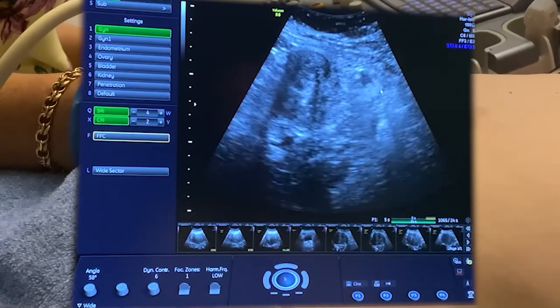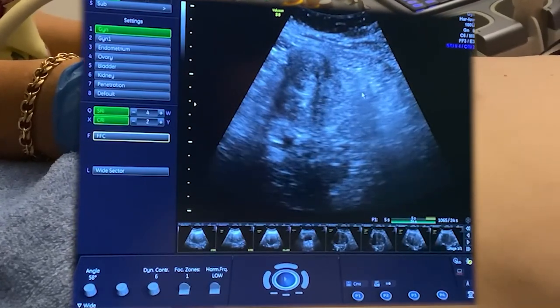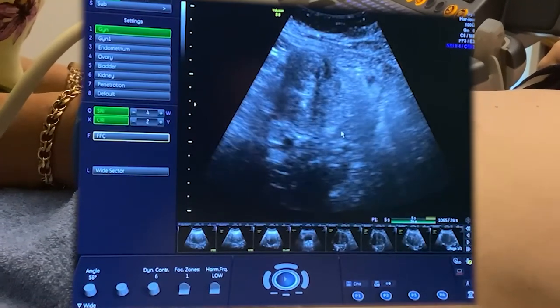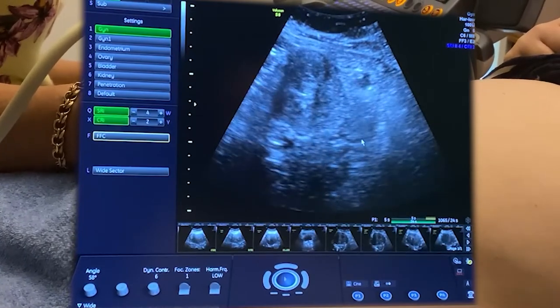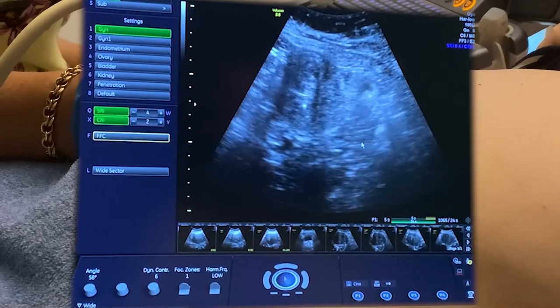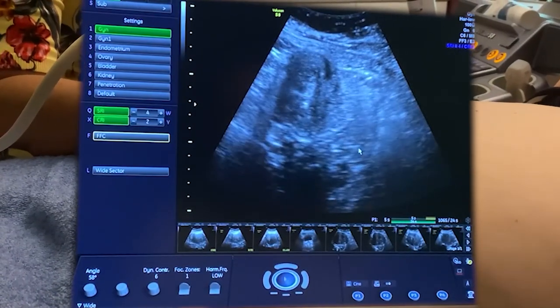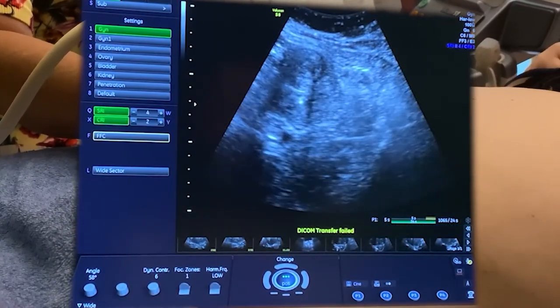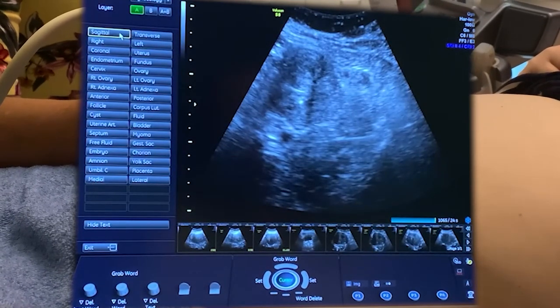As you can see, the bowel here is peristalsing. I'm still in transverse. This is the lateral uterine wall. The bowel is peristalsing. This stays here. This stays the same. It's slightly hypoechoic to the uterus, and we can see the traditional chocolate chip appearance of the follicles on the ovary. Now this patient is postmenopausal, but it's not uncommon to see follicles even in the postmenopausal patient.